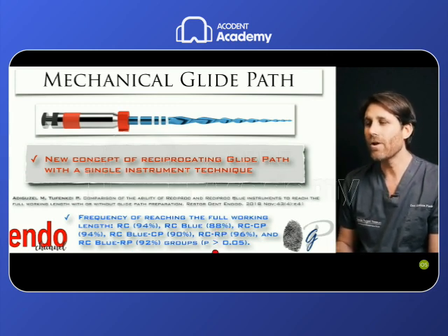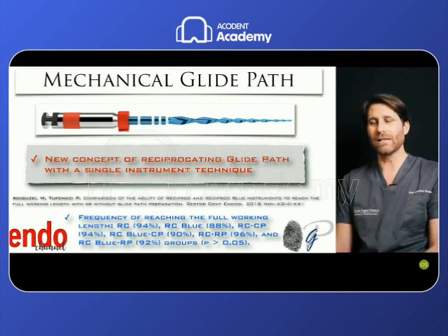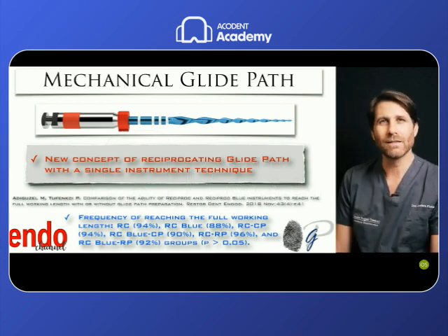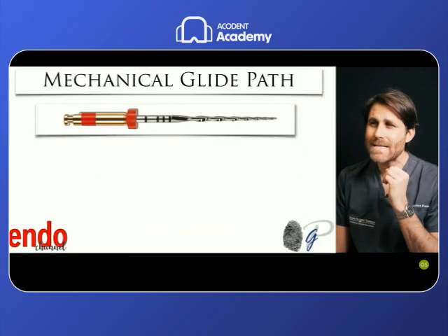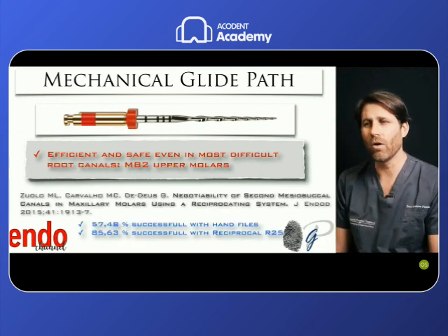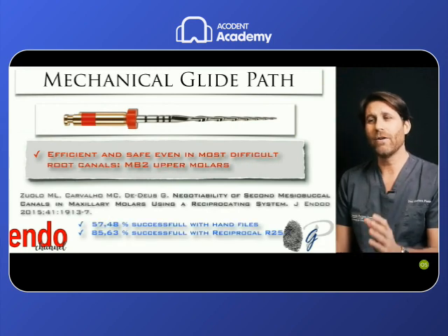So more or less we have the same results and the same efficacy in scouting these canals without any prior hand file before.